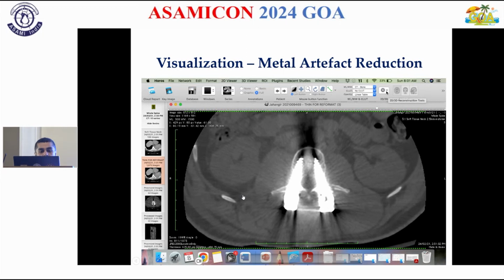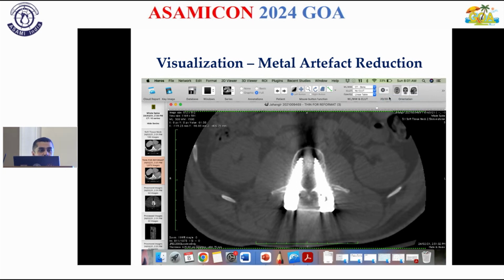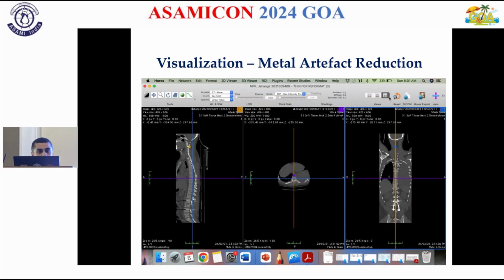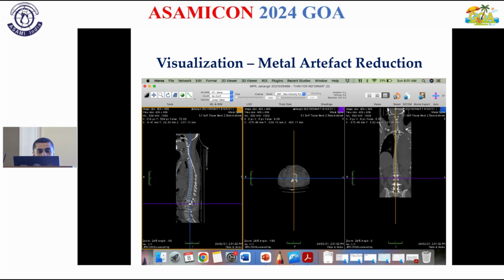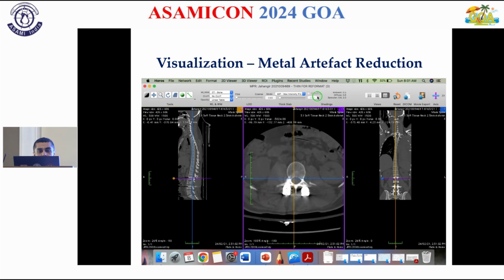Okay. The next common thing that we see is metal artifacts. Metal artifacts can be a big problem, as my colleague from spine gave me this. So, is my screw intra-articular? What do I do? Another very common thing available in all of the DICOM readers. So you go to that area of interest. As you can see here, we blow that up. You see the metal artifacts.